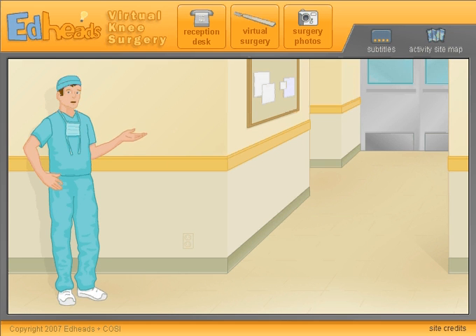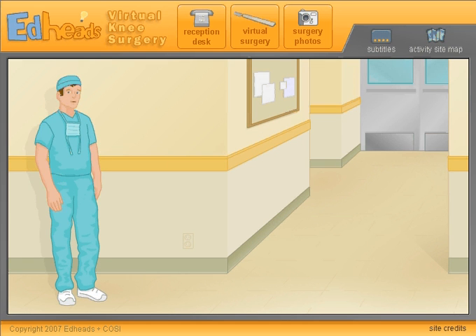Welcome to Virtual Knee Surgery. This activity will show you the process of replacing a failing knee joint. Are you ready?